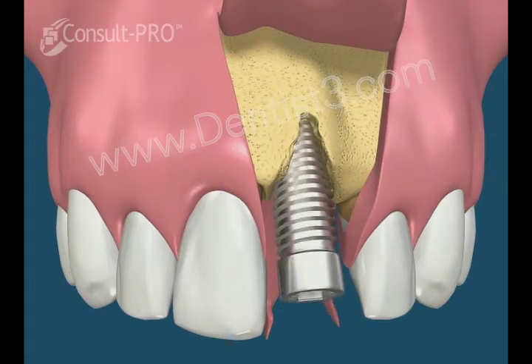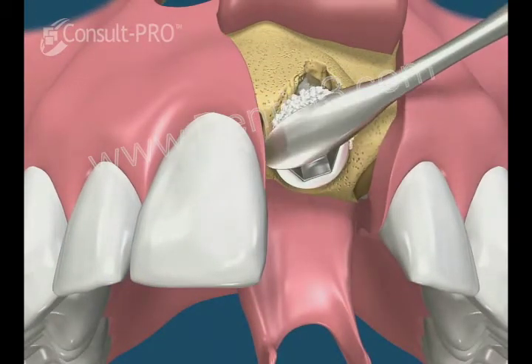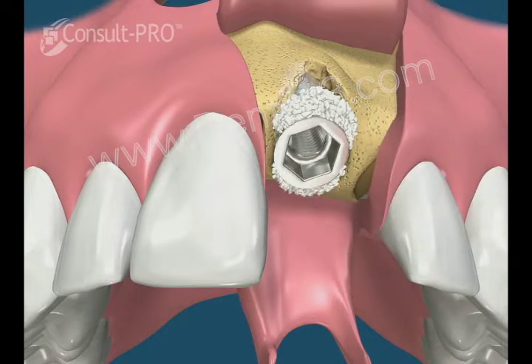The implant fixture is then placed into this prepared site. Note that there is a bone defect on one side. If this defect is small enough, it can also be corrected at the same time as the implant placement.